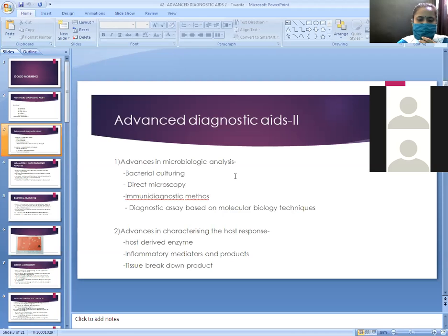Suppose a tooth is there which is not going to change anymore. So the tooth position is not going to change. Only the defect, the periodontal bony defect, whether it is 3-wall, 2-wall, or whatever kind of radiographic bony defect. If you are going to use bone graft to regenerate that particular area while doing the surgical phase of your treatment plan, then you have to assess. These radiographic assessments are useful when you are going to regenerate a periodontal defect.